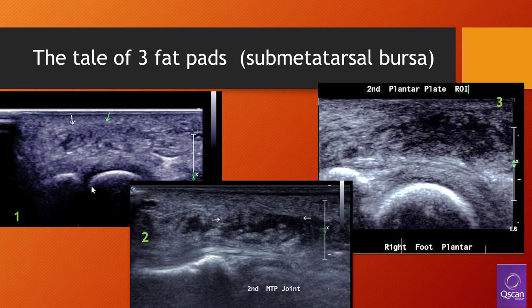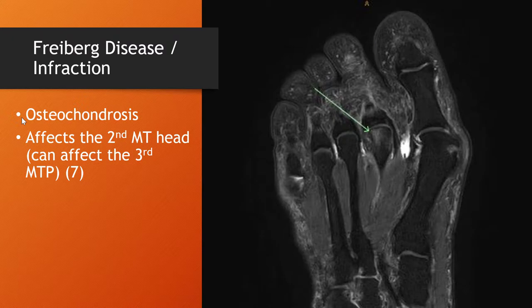3 are common and 1's more exotic, and we'll start with that. And for each pathology we'll discuss the appearance, why it occurs, where it's located, brief technique, along with a wall of shame example, and we'll discuss implications for underdiagnosis. So first to Freiberg disease or Freiberg infraction.